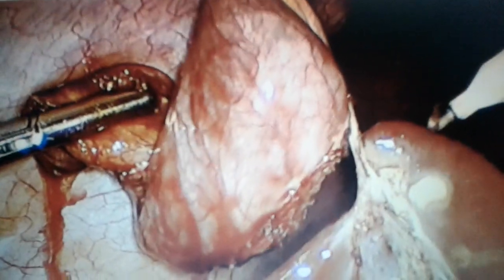So if the leaks are there, no problem, just wait. The gauze is still there and the dissection is almost completed, and we must take out the gallbladder first. As there is no empyema, nothing, the gallbladder is almost not thickened, having a normal gallbladder wall thickness, so don't worry. But the question is still there: for this spillage, what to do?